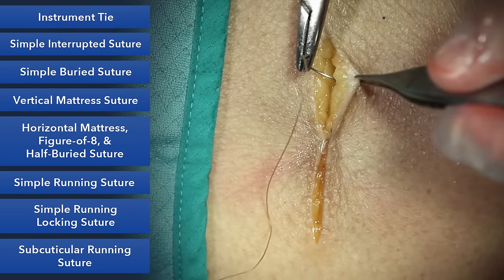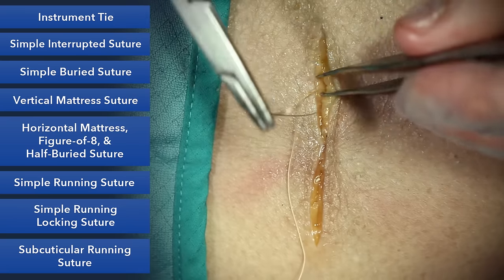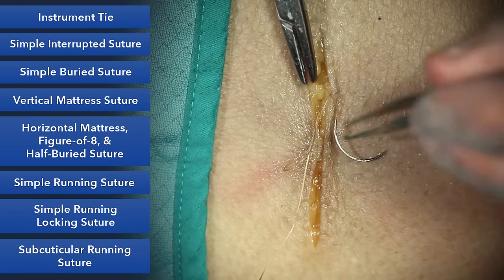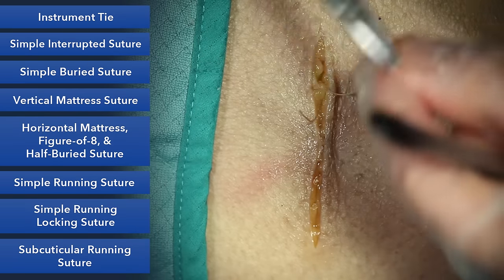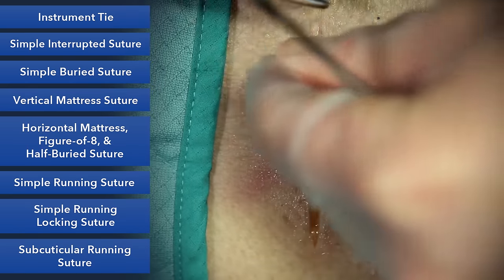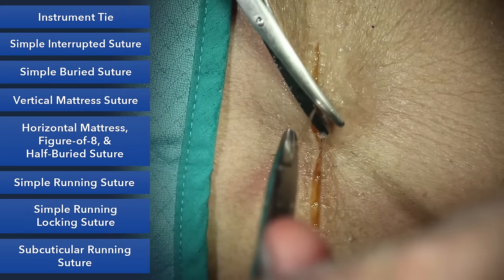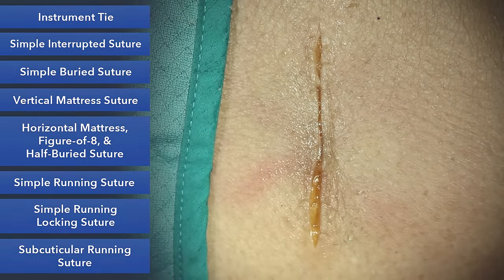You're going to go from deep to superficial without buttonholing the skin. And then go from superficial to deep. Make sure that you're coming out on the same side of the loop. And we'll do our instrument tie, and we'll pull it along the length of the wound so it'll allow it to bury. Come back to the other side, and back to the other side. And that is our simple interrupted buried suture.